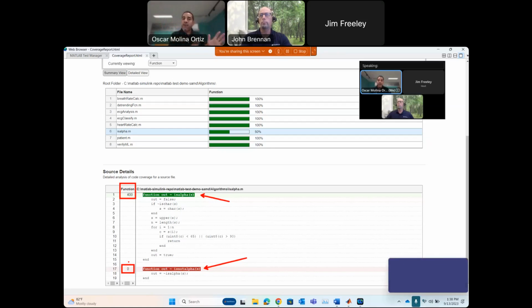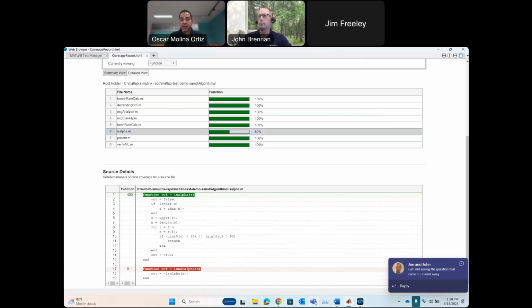However, if you have the requirements, you exactly know what to hit, where to look at it, right?